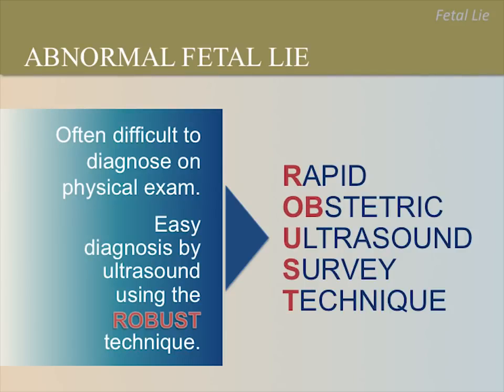Using ultrasound, we can determine the fetal lie easily using the robust technique. We described the robust scan in an earlier lesson. Who can describe how to do a complete robust scan? Please pause the video now to ask a participant to describe the robust scan.